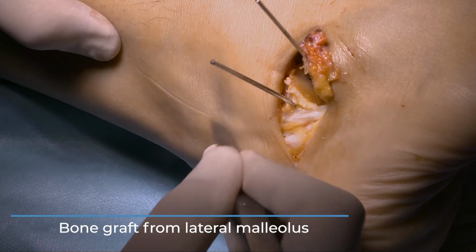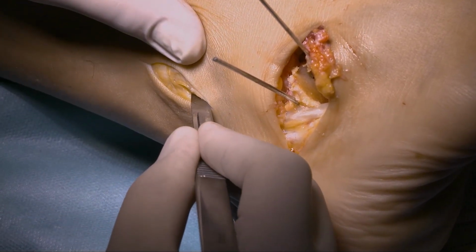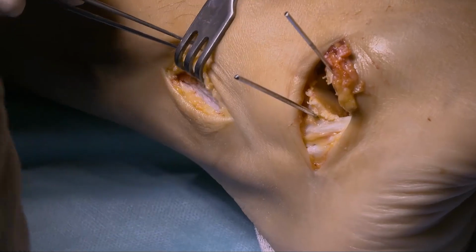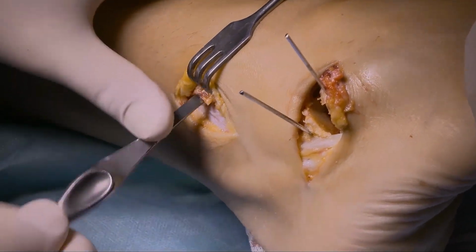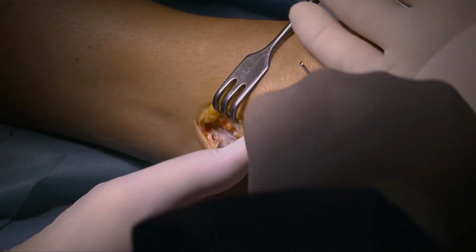The next stage is to take the bone graft from the lateral malleolus. The incision is about 2 cm above its top. This is possible even in children and adolescents, as it is done just above the growth cartilage. This can be treated as a kind of stimulation of the growth cartilage.